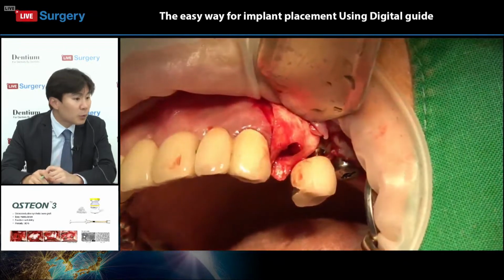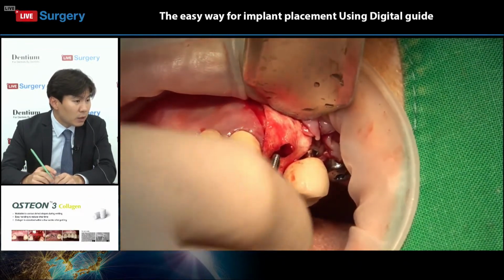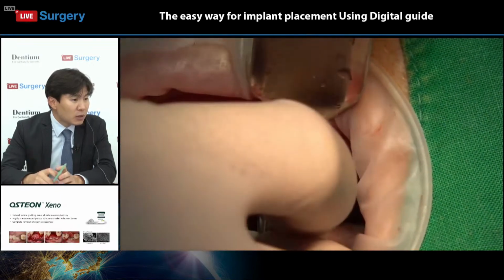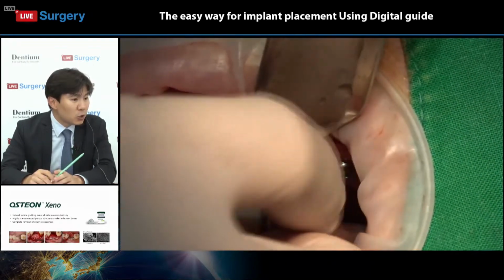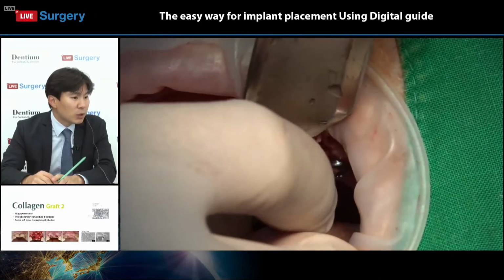The height of this abutment was 5 millimeter, but he thinks 5 millimeter is not enough. So he changed the abutment from 5 millimeter in height to 7 millimeter in height.